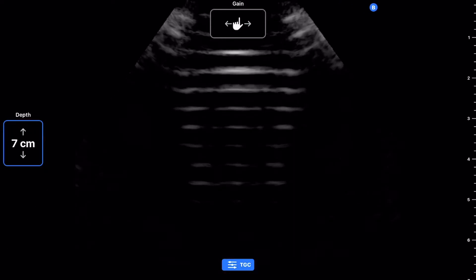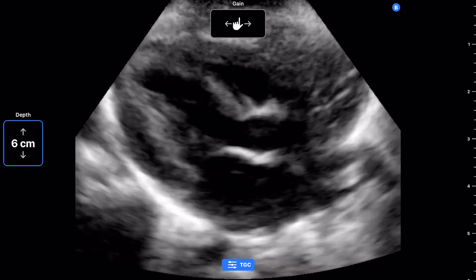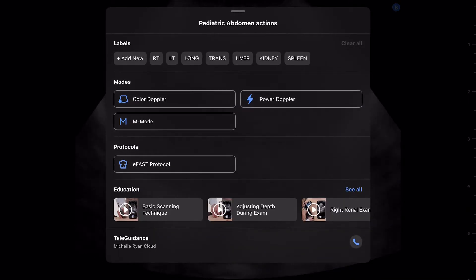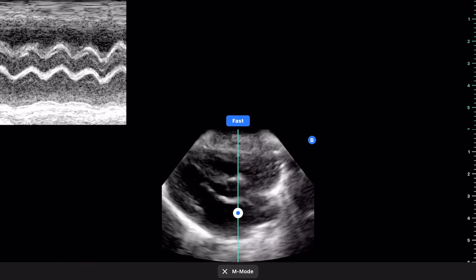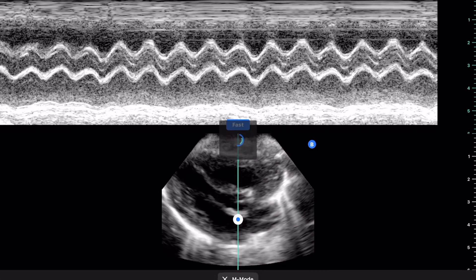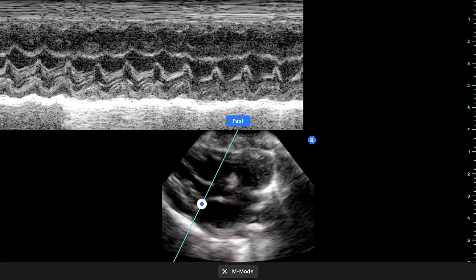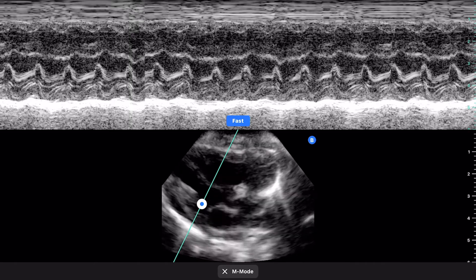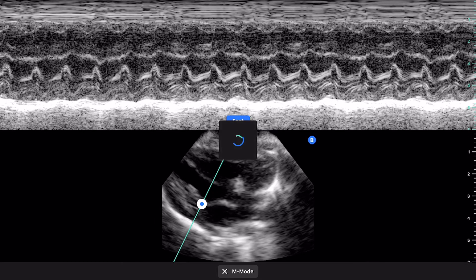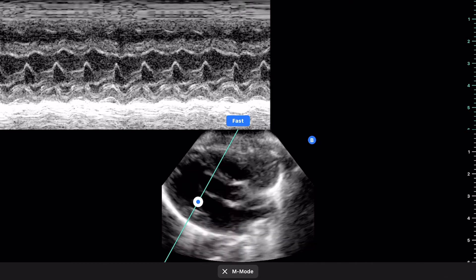Here we are obtaining a parasternal long axis view on our patient using the pediatric abdominal preset, and you can see that our marker for the ultrasound probe is on the right side of the screen as per the cardiology convention. In this view we can appreciate the left ventricle. We can use the M-mode line of interrogation through the aorta to the left atrium to calculate the left atrial to aortic ratio, and also through the tip of the mitral valve to measure the shortening fraction as well as end-diastolic and end-systolic diameter of the left ventricle. We can use this view to do sweeps to look at the relationship with the right ventricle and the RV outflow tract.